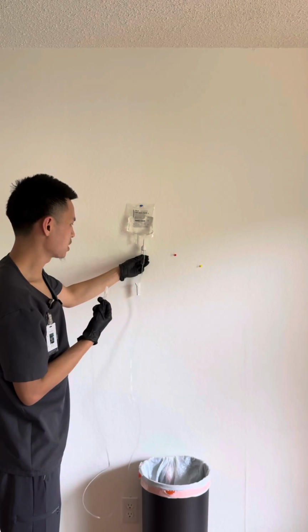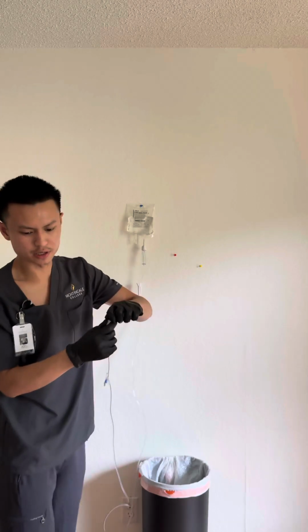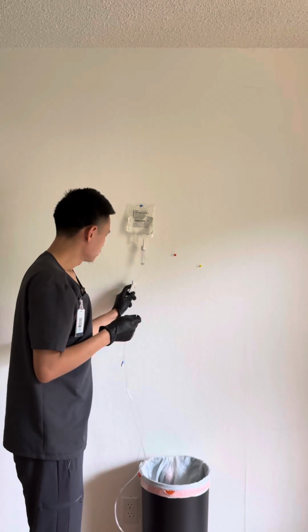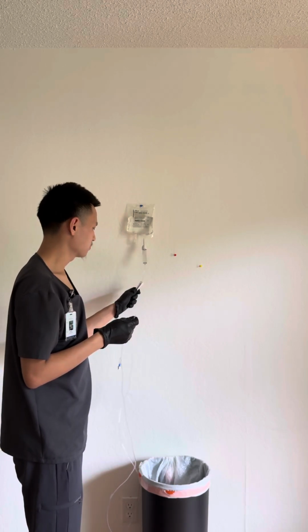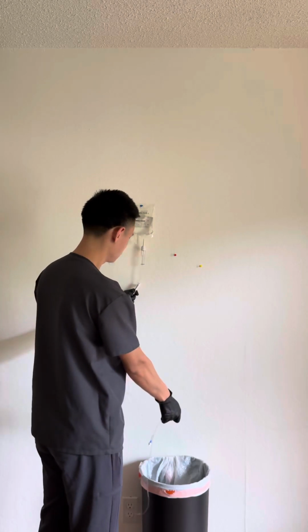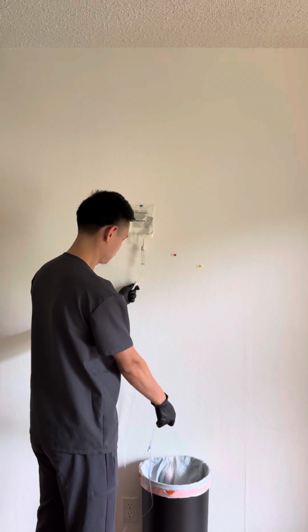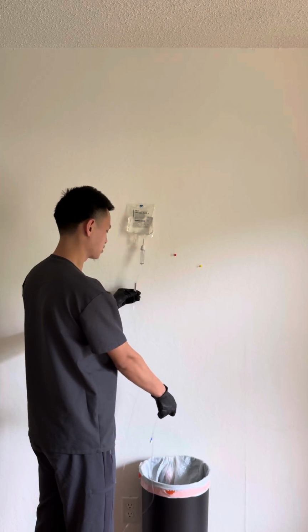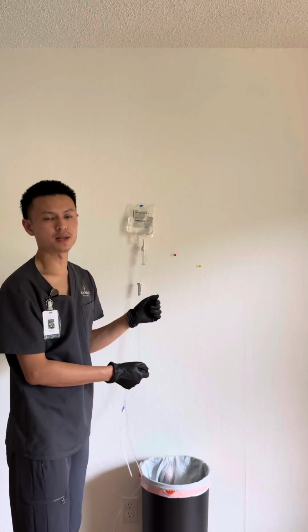This is where I will squeeze the chamber and make sure that the fluid fills about halfway. I will remove the cap to the primary tubing. And then I will slowly roll the roller to the wider side so that I can prime the tubing, just removing any air. Once it is primed, I'm going to roll it back to the off position. And then I will be counting the drips per minute.